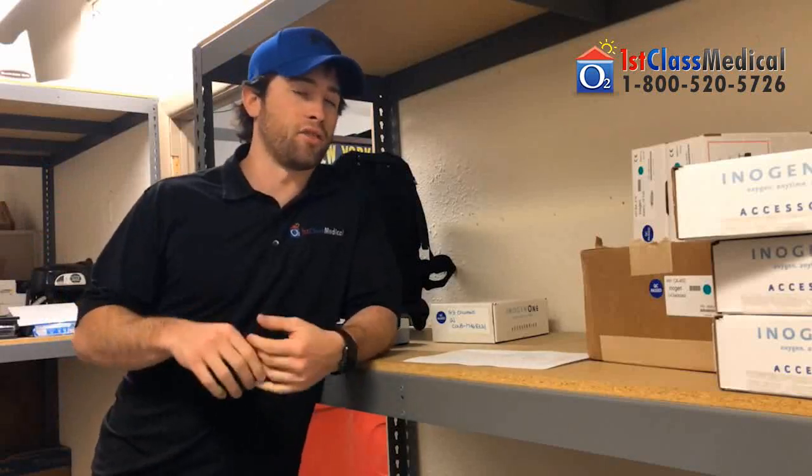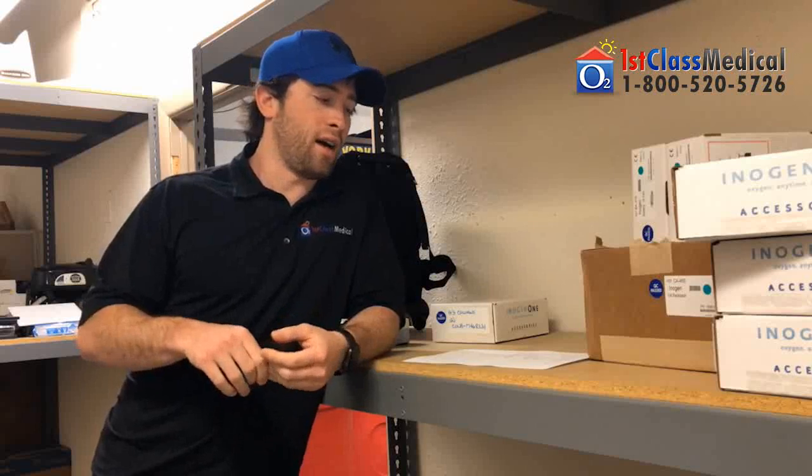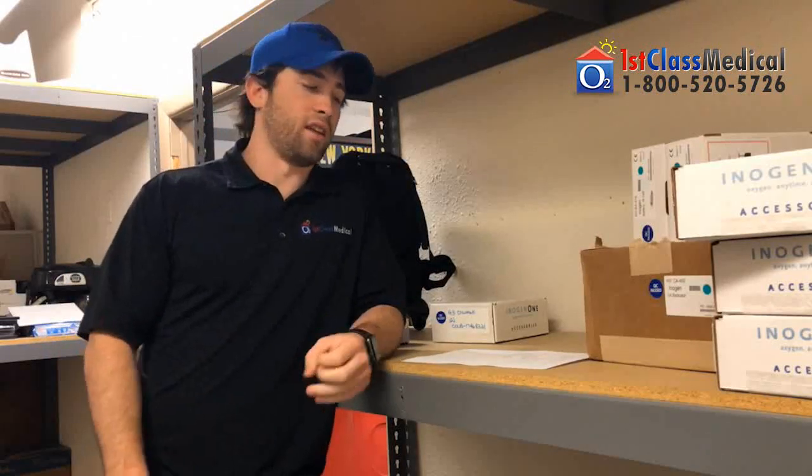It tells you your oxygen levels and heart rate. That's what I would recommend if, for example, you're wanting to do a pulse flow and normally people are prescribed continuous flow. Go talk to your doctor. Go get those tests done. They'll let you know if a pulse flow is good for you. But most commonly, people that use continuous can also use pulse.